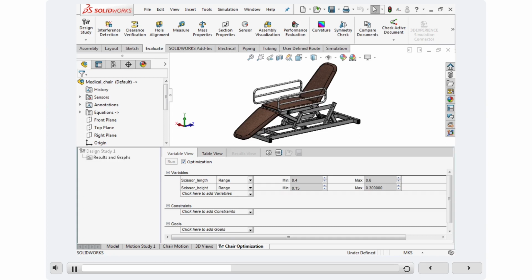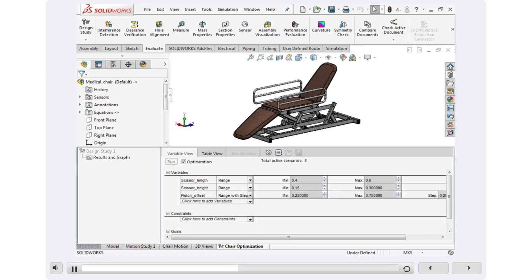Now, we will add the last variable with piston offset as the name, global variable as the category, and 0.5 as the value. Under Variables, click the drop-down arrow corresponding to the variable piston offset. Click Range. Enter the value 0.5 as the minimum of the range, and enter 0.7 as the maximum of the range.